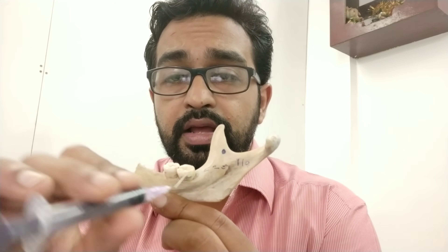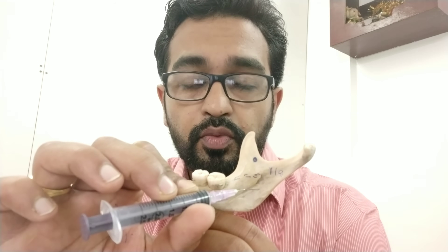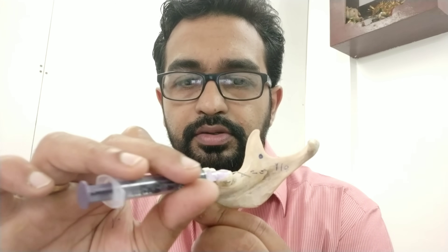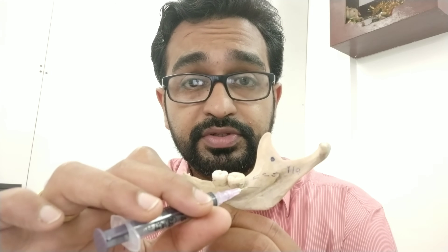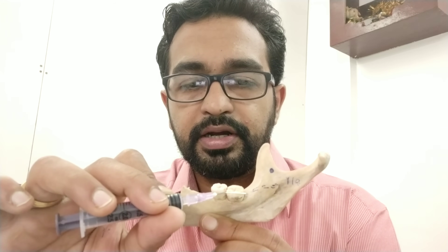If bone is not contacted after inserting 20 to 25 millimeters, slightly retract the needle and with the same angulation, change the direction of the needle and reinsert. You will then hit the bone. Retract it one millimeter so you do not inject into the periosteum, and deposit the local anesthesia where the inferior alveolar nerve lies. If you hit bone too anteriorly, retract, redirect more posteriorly, and go deeper.